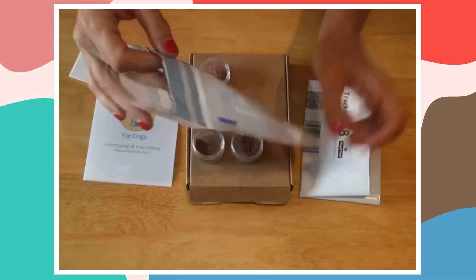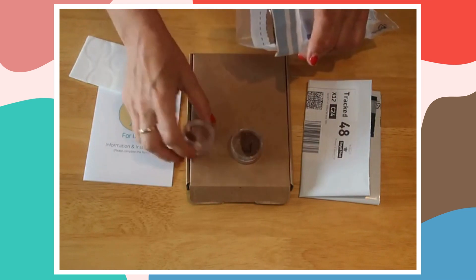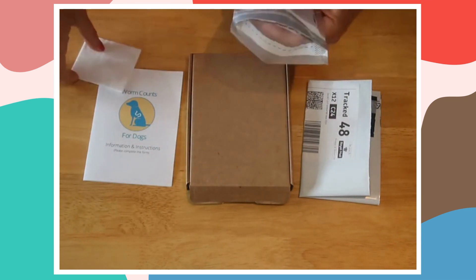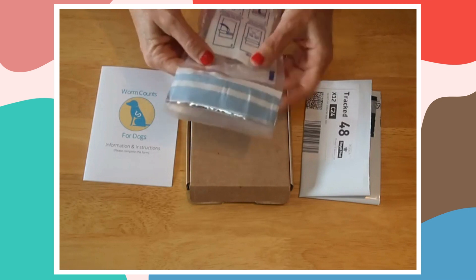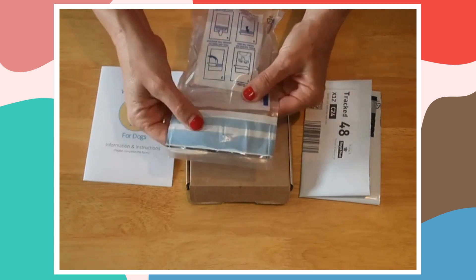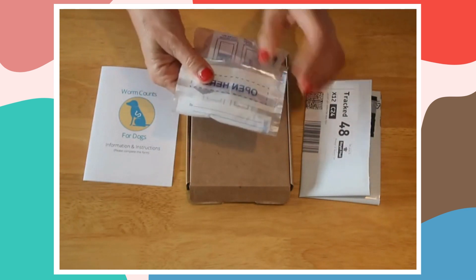Now, taking your sample bag, put the samples in. There's a little moisture strip in there in case anything leaks. Put that in, get rid of any excess air, peel off the tape, tape it and press it down so it's sealed.